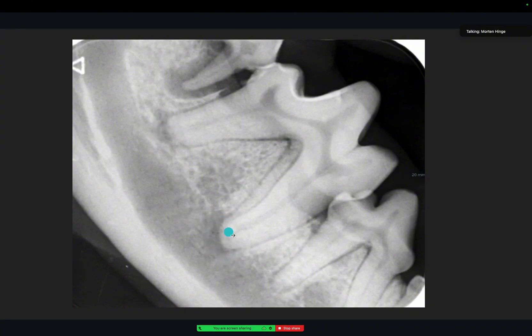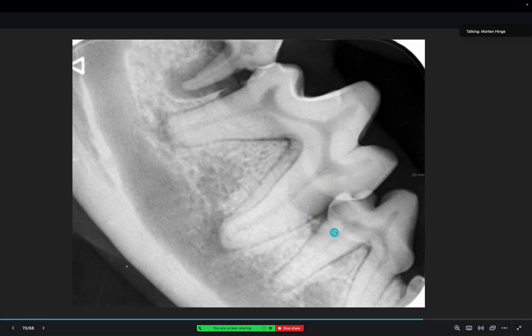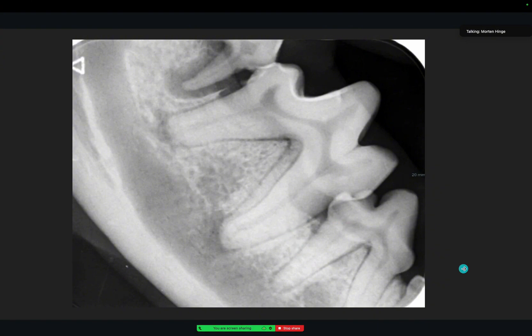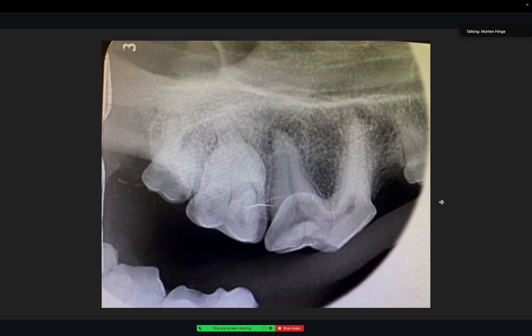These are some examples of real lucencies right here. When you see a lucency like that, you can do endodontic treatment — root canal therapy — unless it has tooth resorption or periodontitis like here, so it's not the best candidate. It has bone loss here and bone loss here. You may resolve it by removing this, but it's going to be a long journey for this tooth and this owner — probably best to extract it.